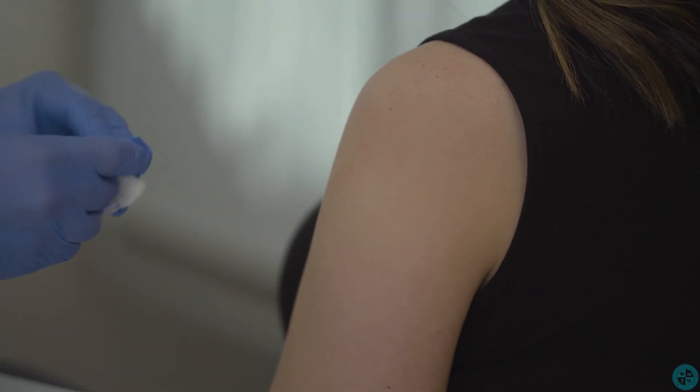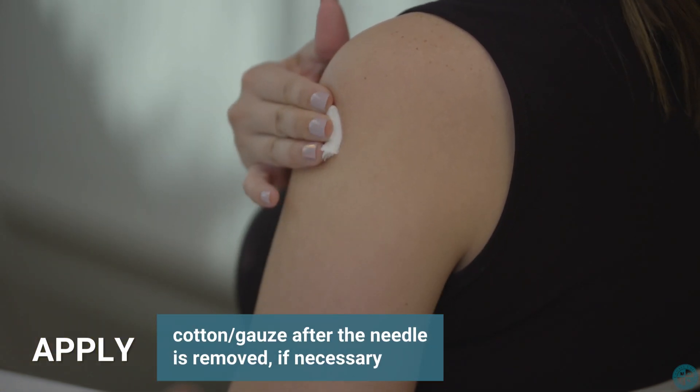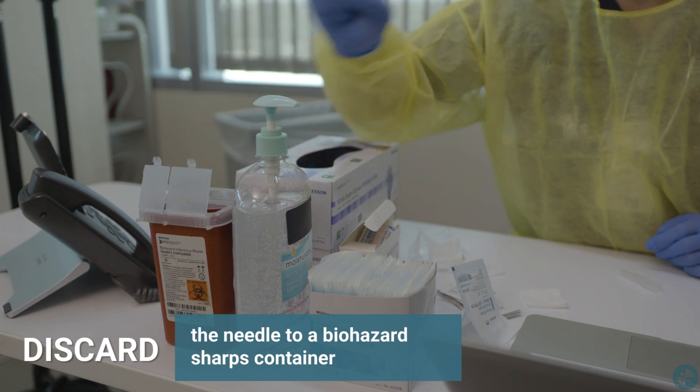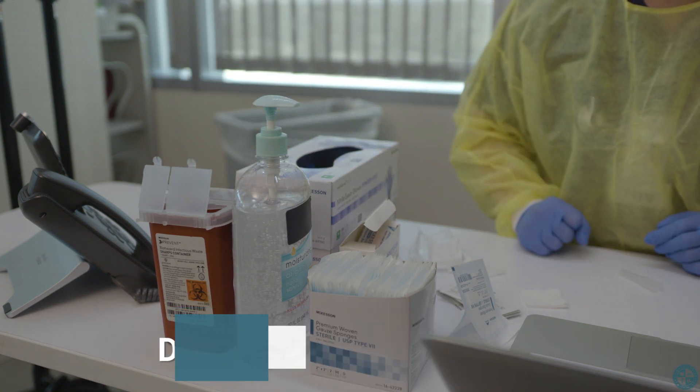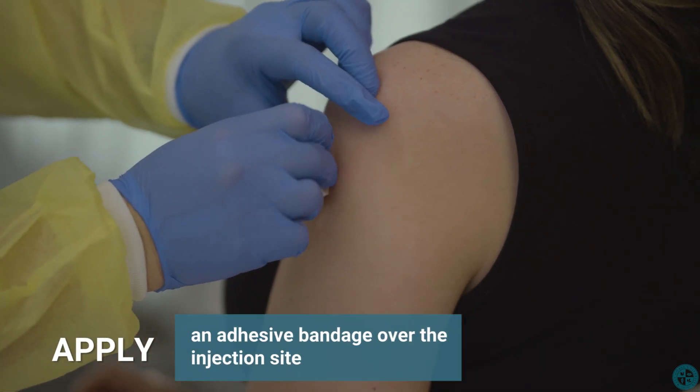If necessary, after the needle is removed, apply cotton or gauze to the injection site. Discard the needle to a biohazard sharps container right away. And finally, apply an adhesive bandage over the injection site.